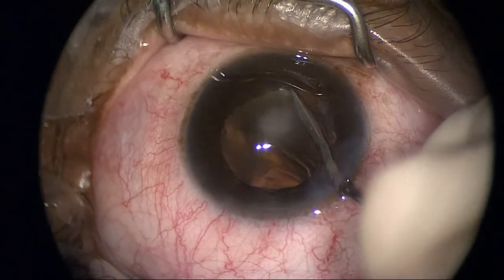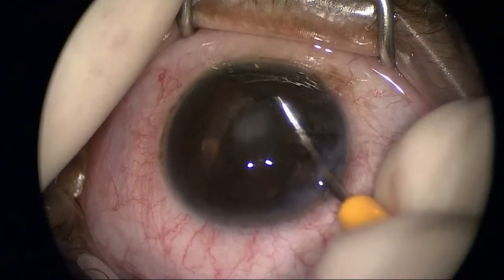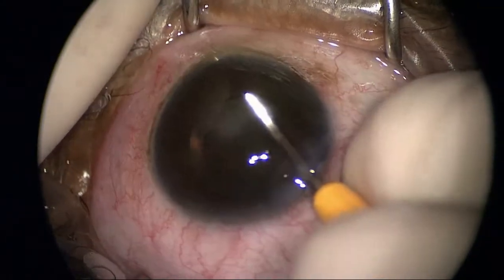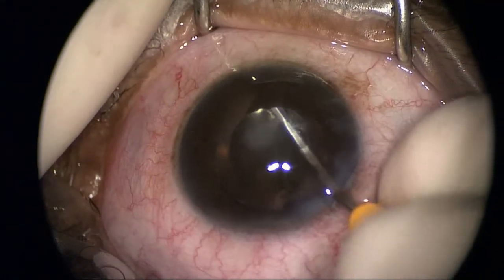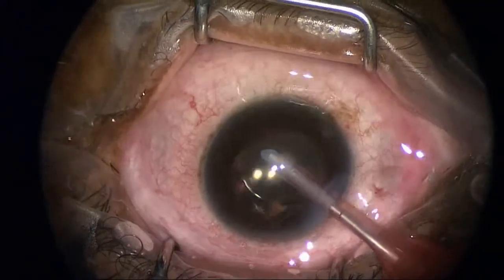This is a procedure I've started doing recently that involves creating an inferior peripheral iridectomy from posterior to anterior. It reduces the risk of having really high intraocular pressures related to a pupillary block that develops from air anteriorly.